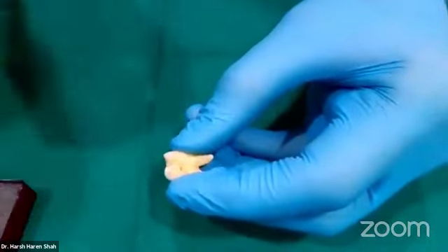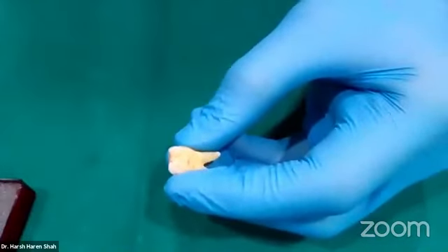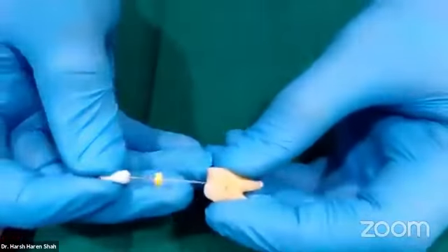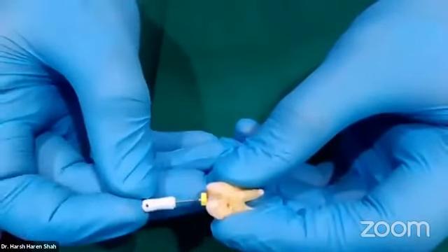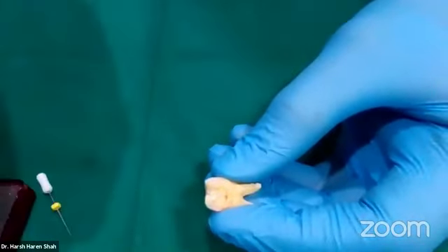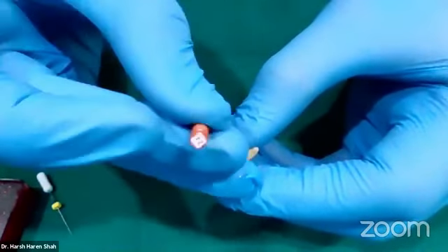After this, you can move to your 15 number K file. I'll just adjust the length on this 15 number K file to 15 millimeters. If you feel that it is reaching the apical end or the complete working length easily, well and good. If it does not go till the full working length, there are specialized files which are available, like for example, this 12 number K file here. Yeah, I guess that is clear. It's upside down. Yes.